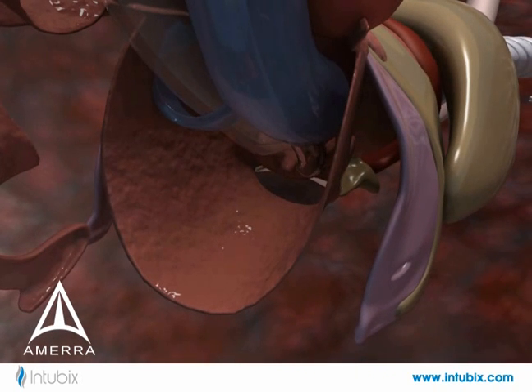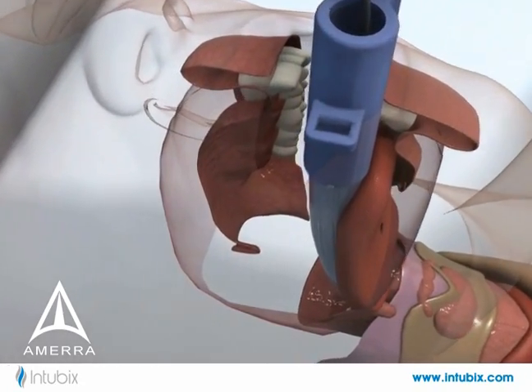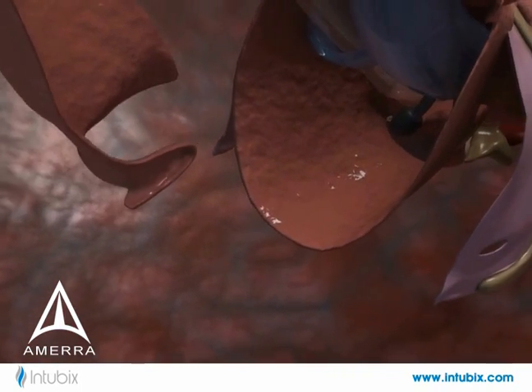The side port can also be used for suctioning secretions from the back of the throat in order to prevent infection. Or the channel is large enough to guide a temperature probe into the esophagus.